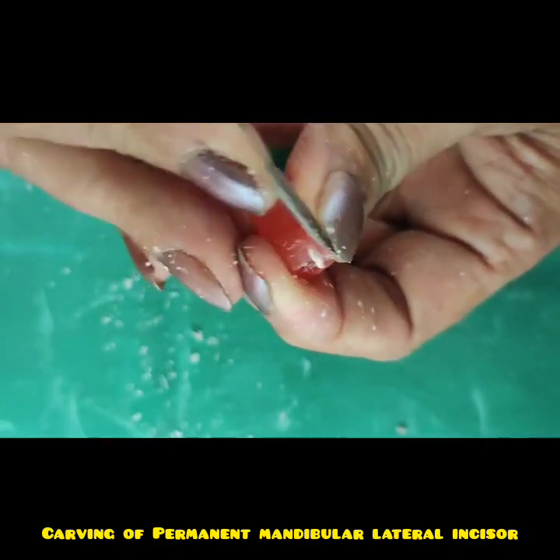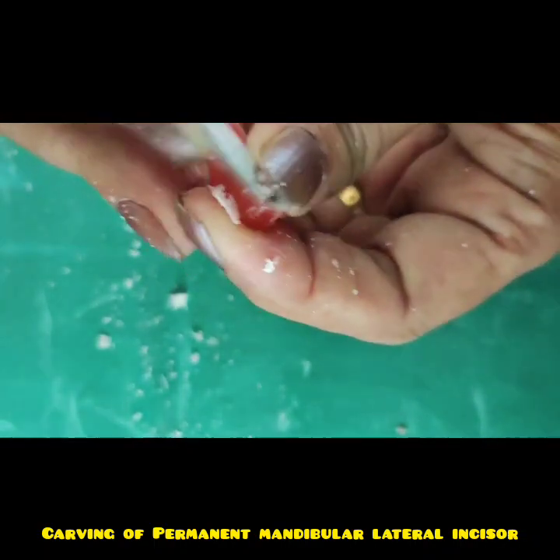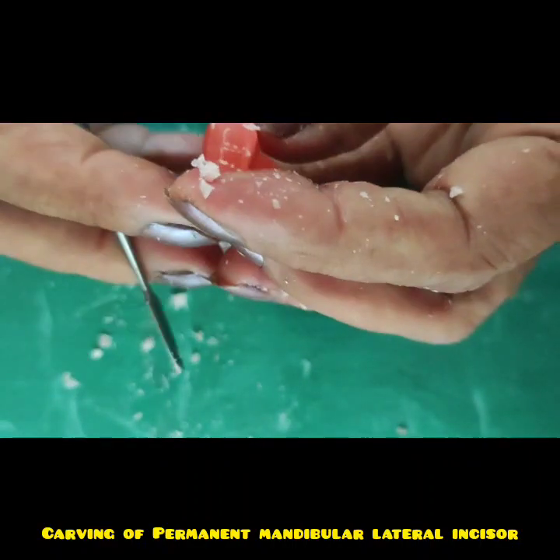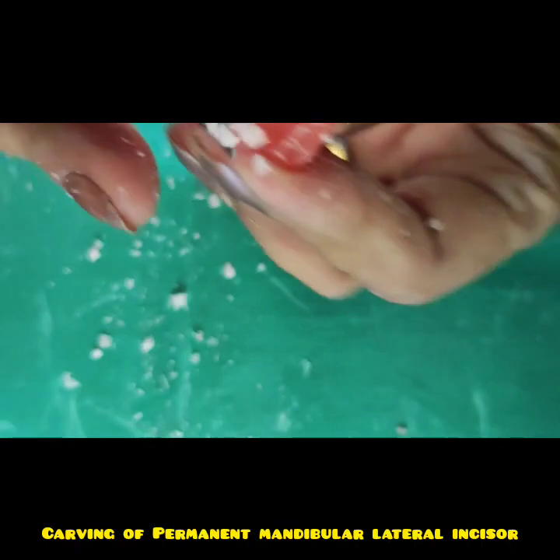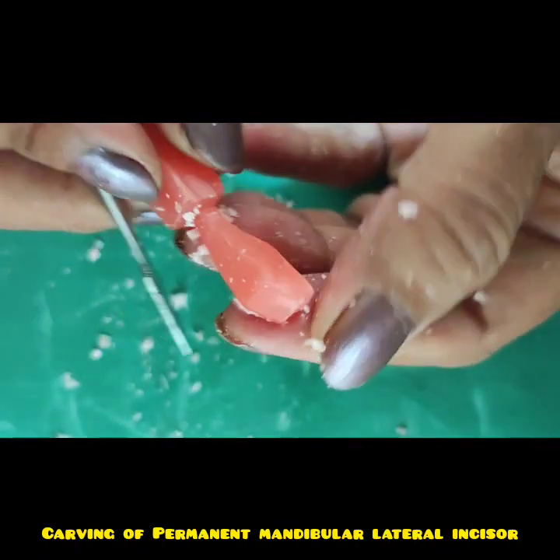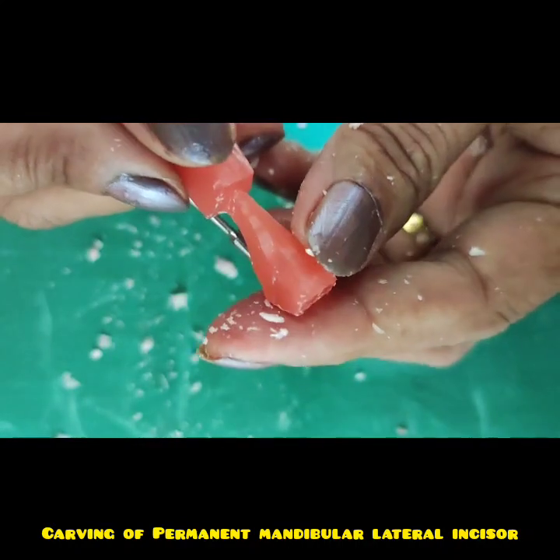So the upper 2/3 I will reduce with one of the line angles of the straight end of the carver till I reach this central line. So this is how I have reduced the upper 2/3 and given an inclined plane.